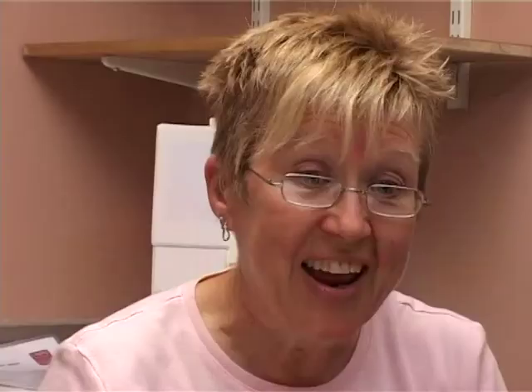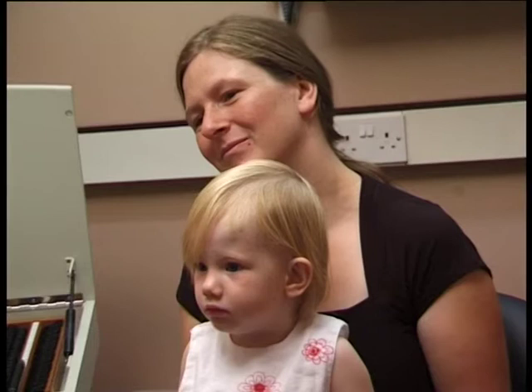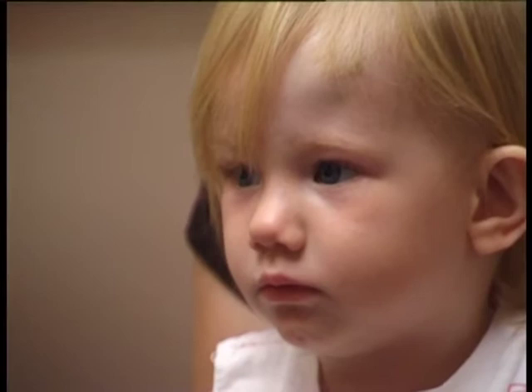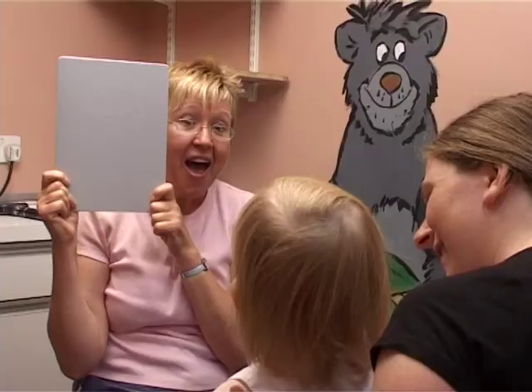We begin by shuffling the card so I don't know where the picture is going to be. We show the card and Arwen looks up; the second card and Arwen looks down. We were right — the picture was at the top of the card the first time and at the bottom the next time. Watching again without seeing where the picture is first: Arwen looks up both times. Two out of two correct — we move on to the next visual acuity level.